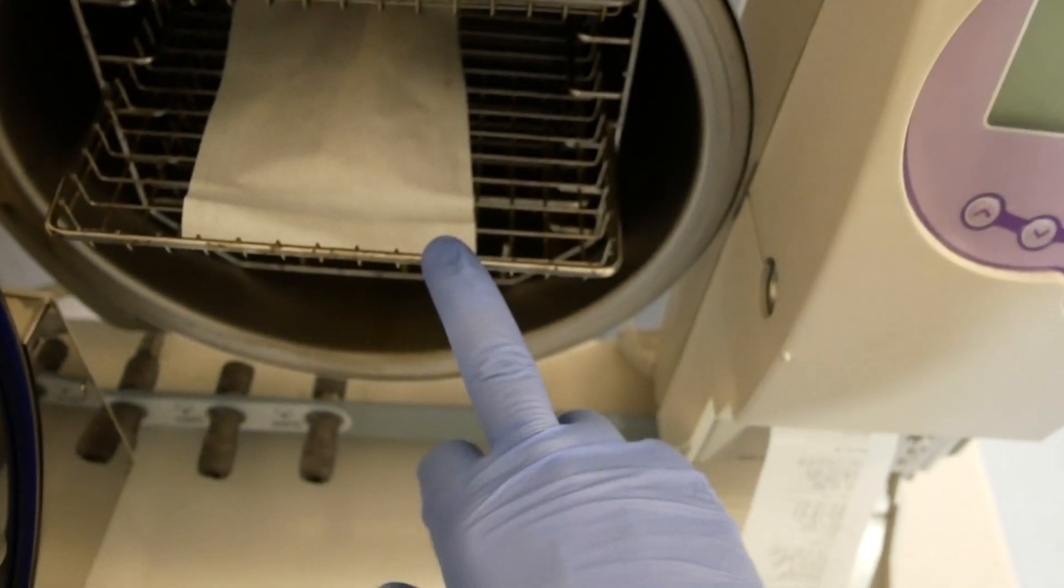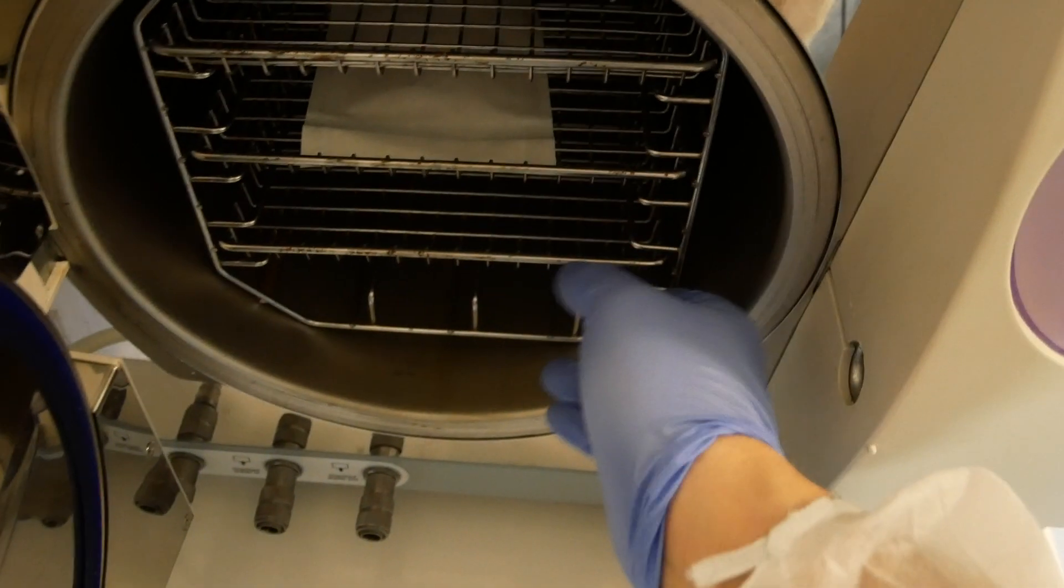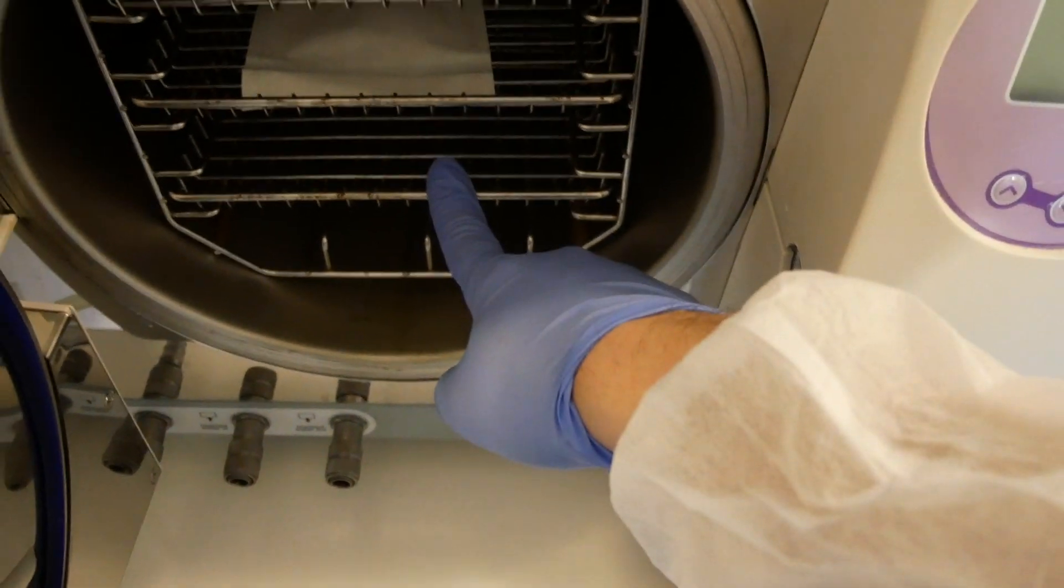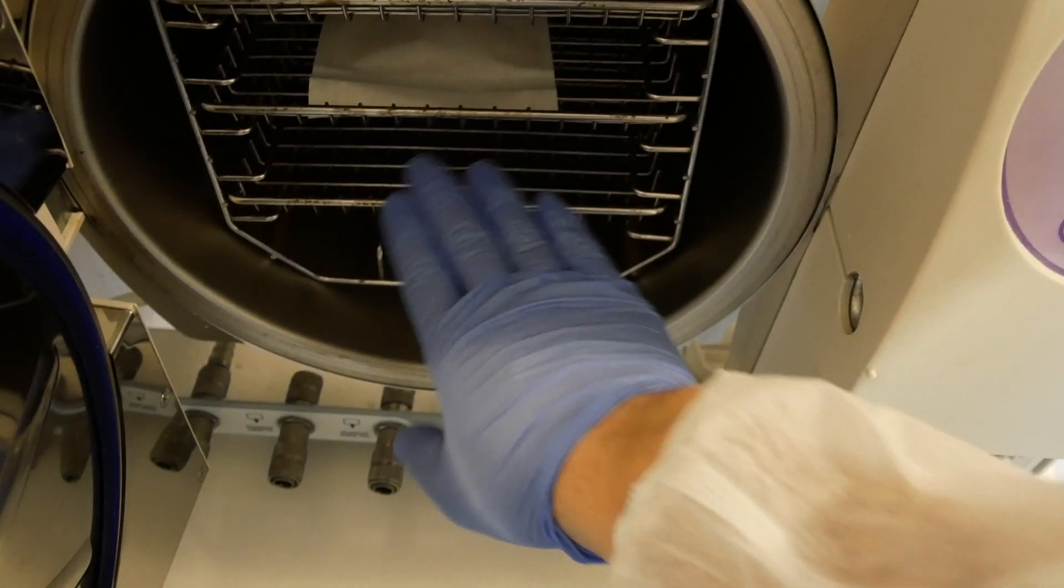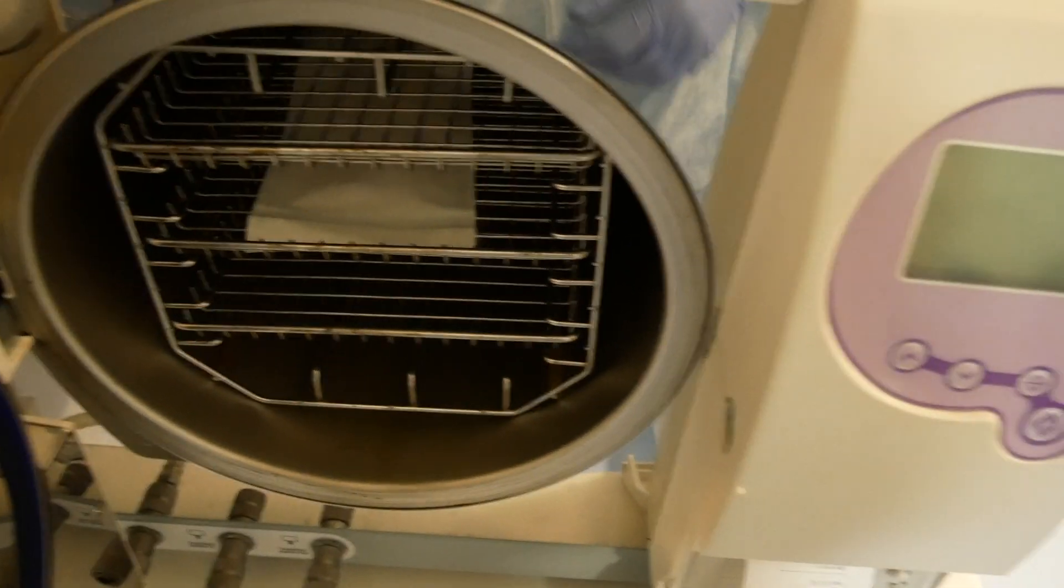Also, a class 5 indicator strip goes with every sterilization cycle. This ensures everything is checked and in order, and it's an extra measure you can take to ensure you have a proper sterilization cycle.